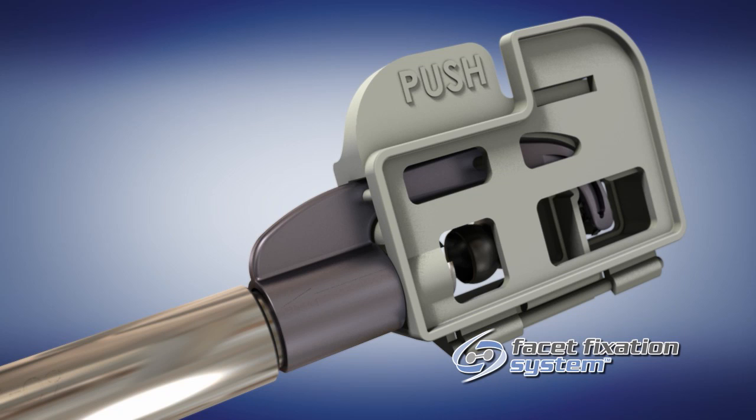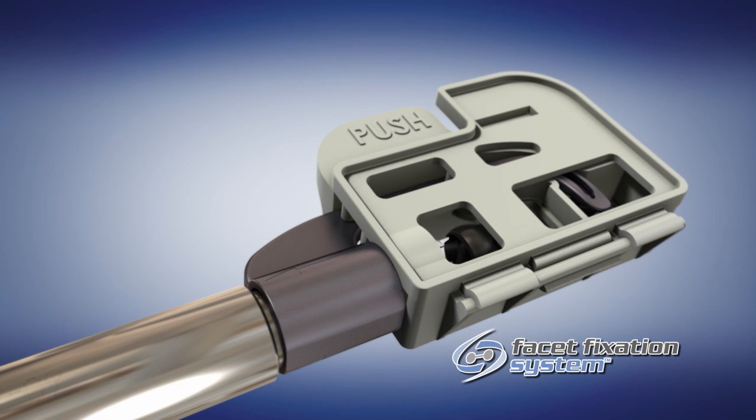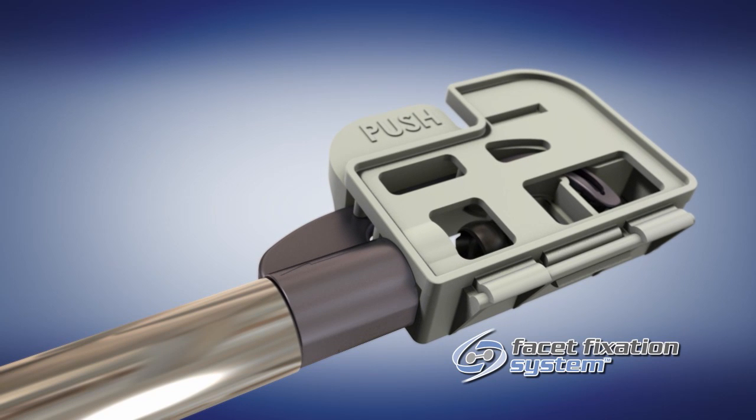Push forward until fully seated. Turn the cassette counterclockwise until it stops and thread the outer locking tube clockwise until it is tightly seated against the end of the metal bridge.